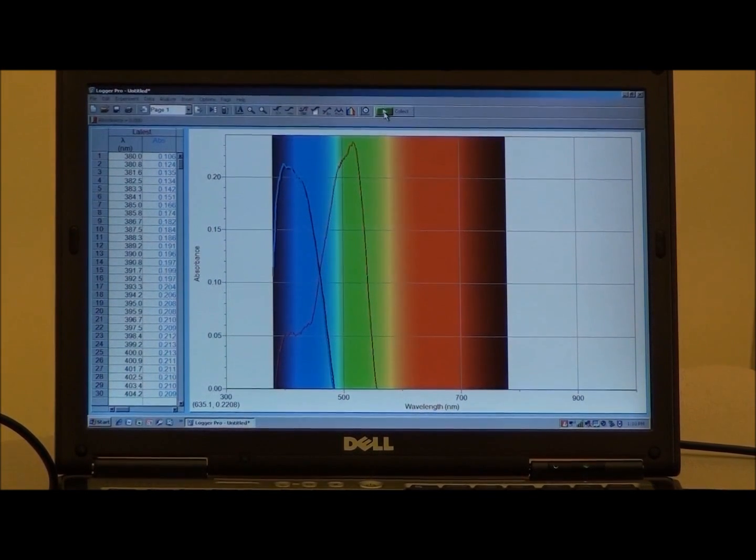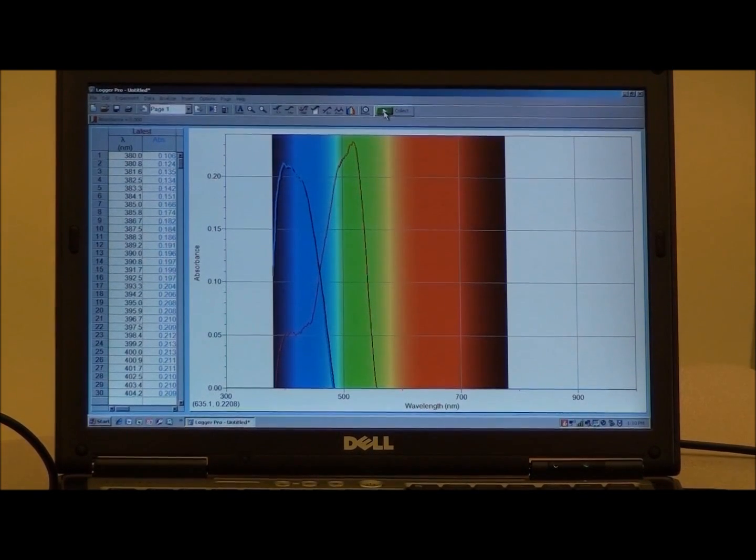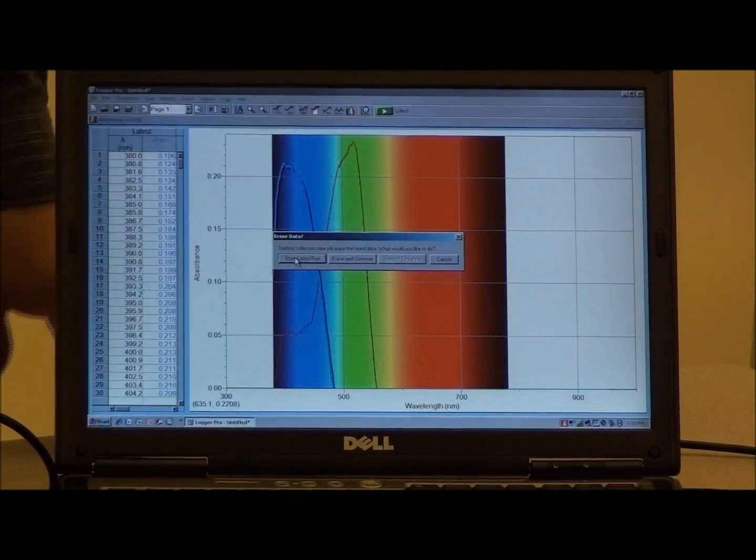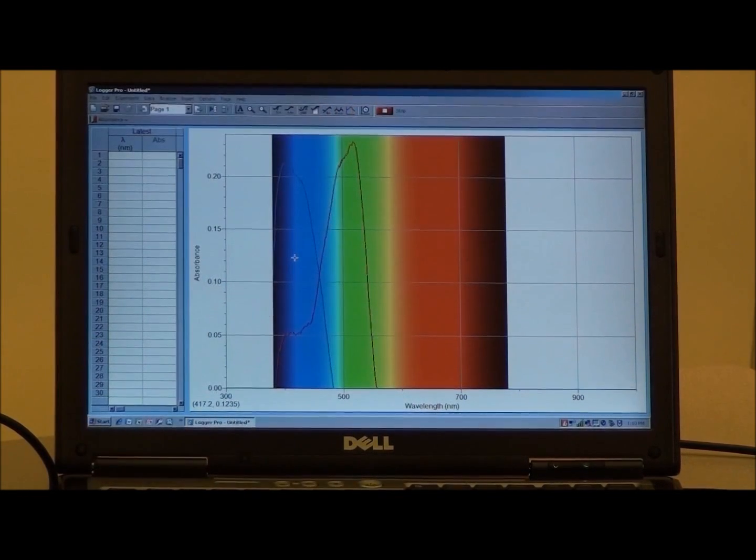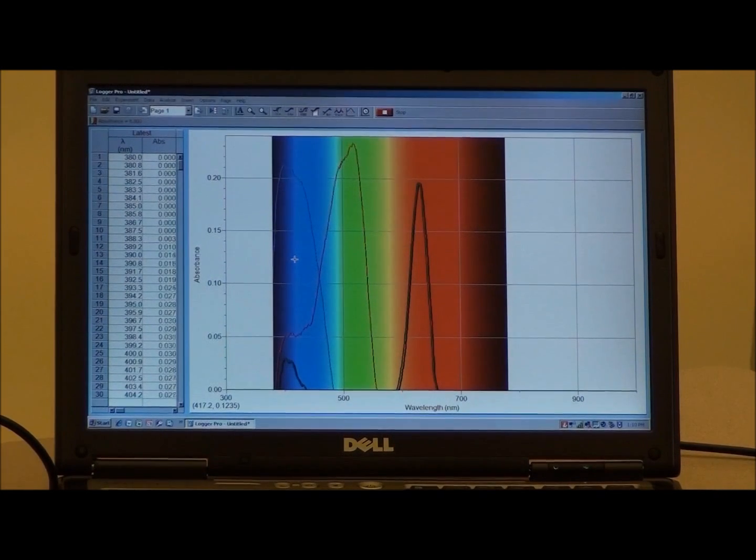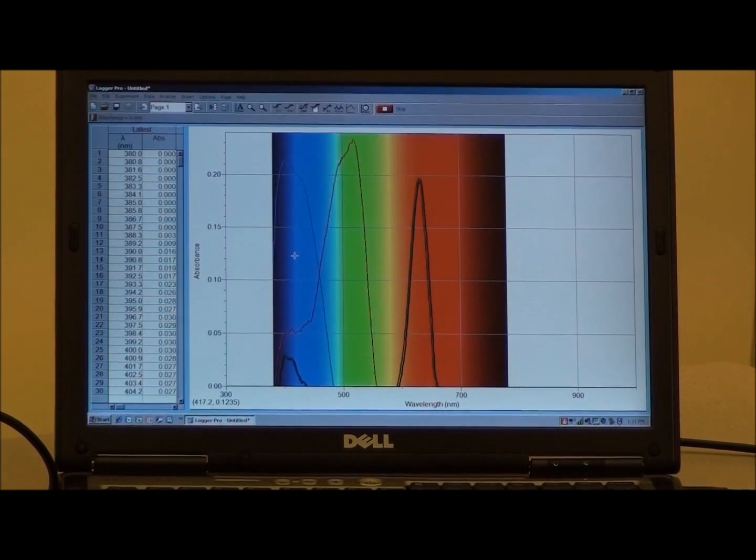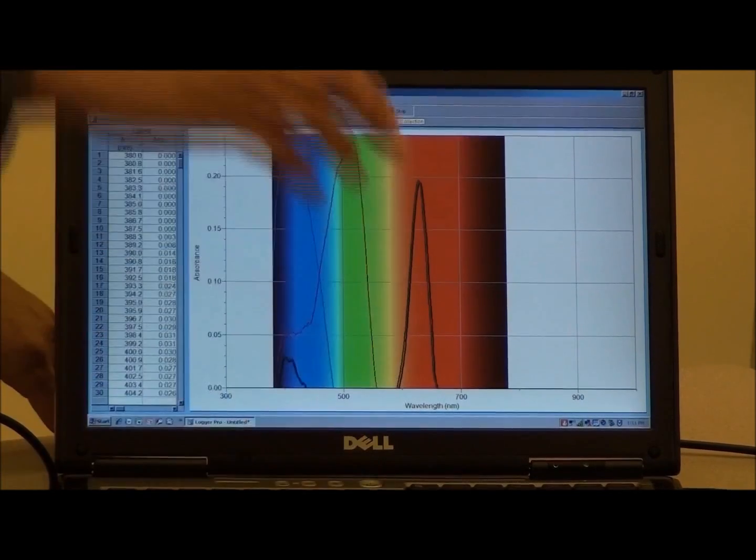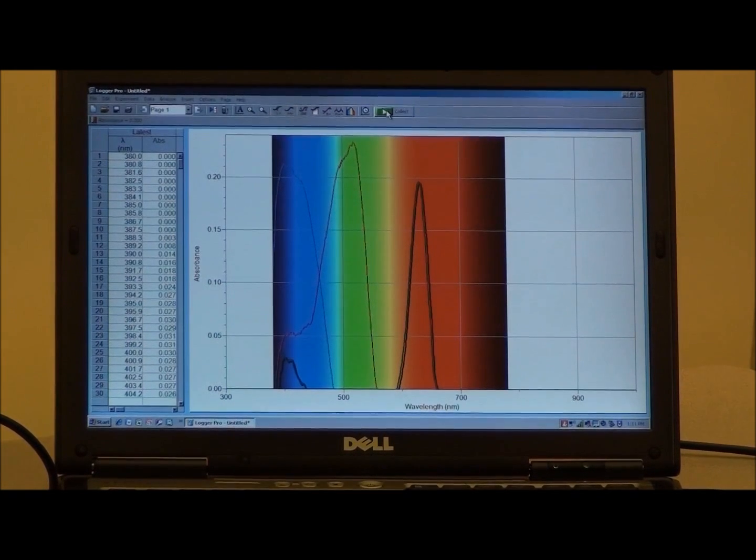The next solution that we will measure is a blue solution. We see the blue solution strongly absorbs in the red region and it also has a minor component in the blue and violet regions. What these three solutions show are that the primary colors have very different absorption spectra. If one were to measure a solution with those colors, one can choose the appropriate wavelength at which to make the measurements.